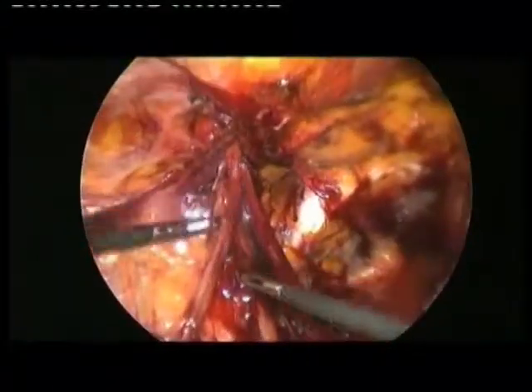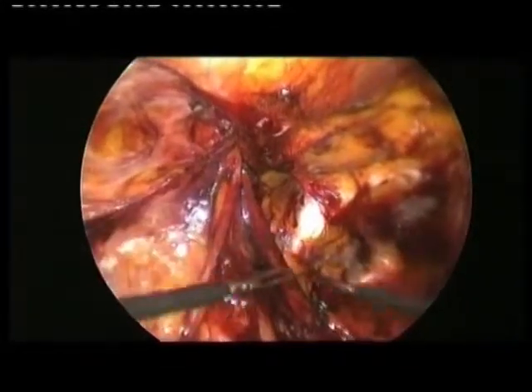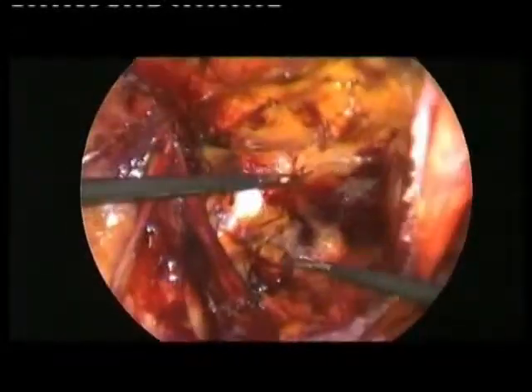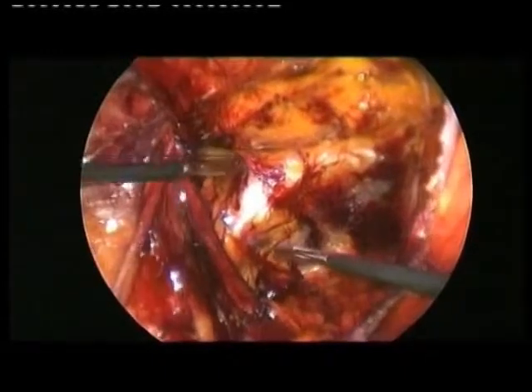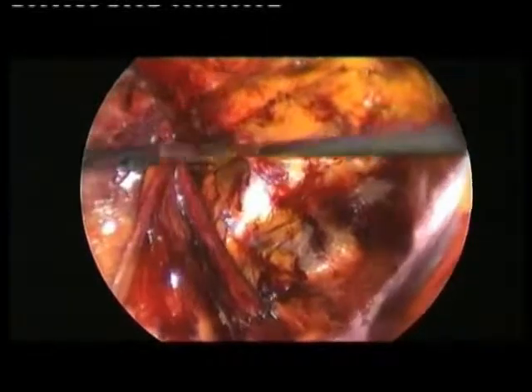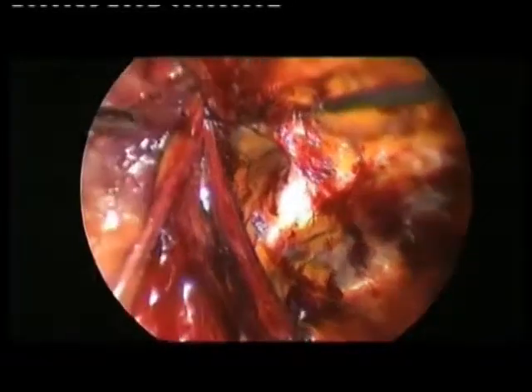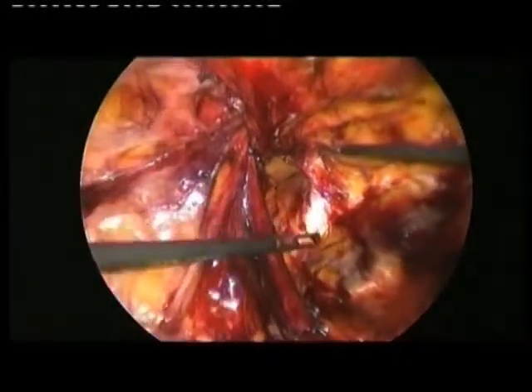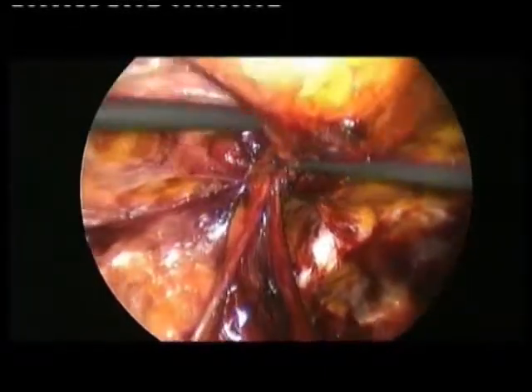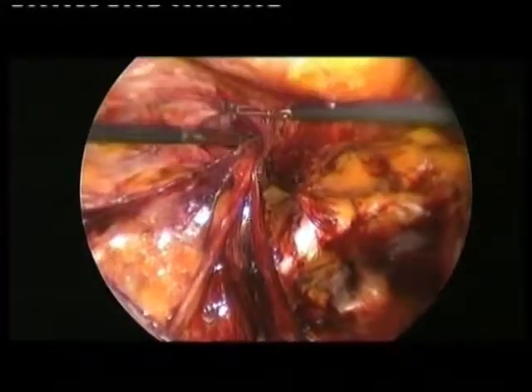This is spermatic vessels. This is the deferent. I always prepare 1, 2, 3, 4 centimeters below the inguinal ring. This is Cooper ligament, and this is the recurrent hernia, the crural hernia. Because the crural hernia is comprised between the inguinal ligament, that is this, okay, and Cooper ligament, and this is the big external indirect hernia, okay?